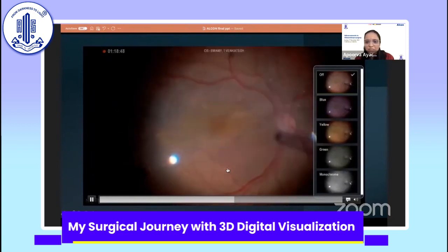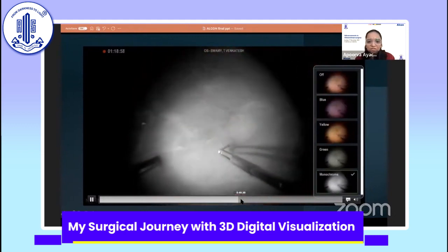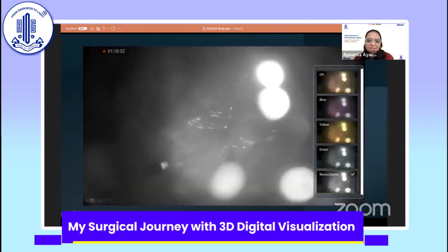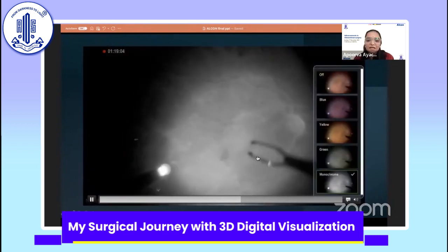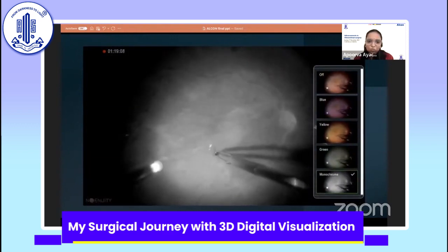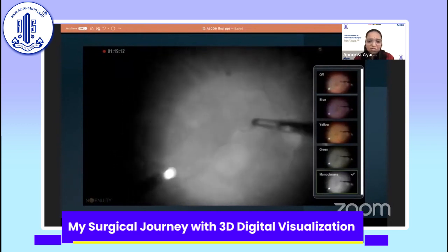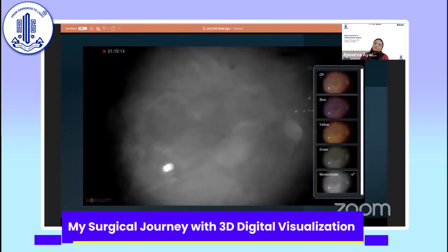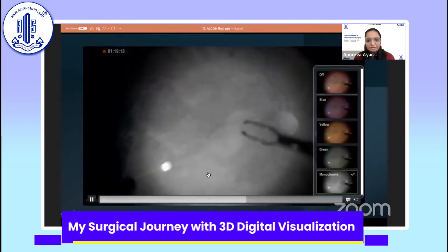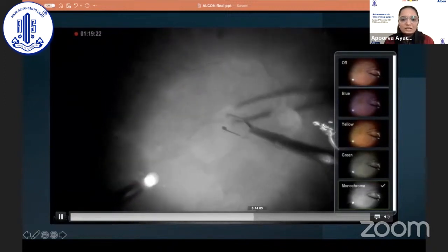This is the filter off. See this monochrome filter. I found this really something extraordinary compared to the other filters. Although, you can do it without filters. Honestly, obviously, like everybody else is having, you don't need any fancy filters to do this kind of peeling. But I found this monochrome to give an excellent contrast.